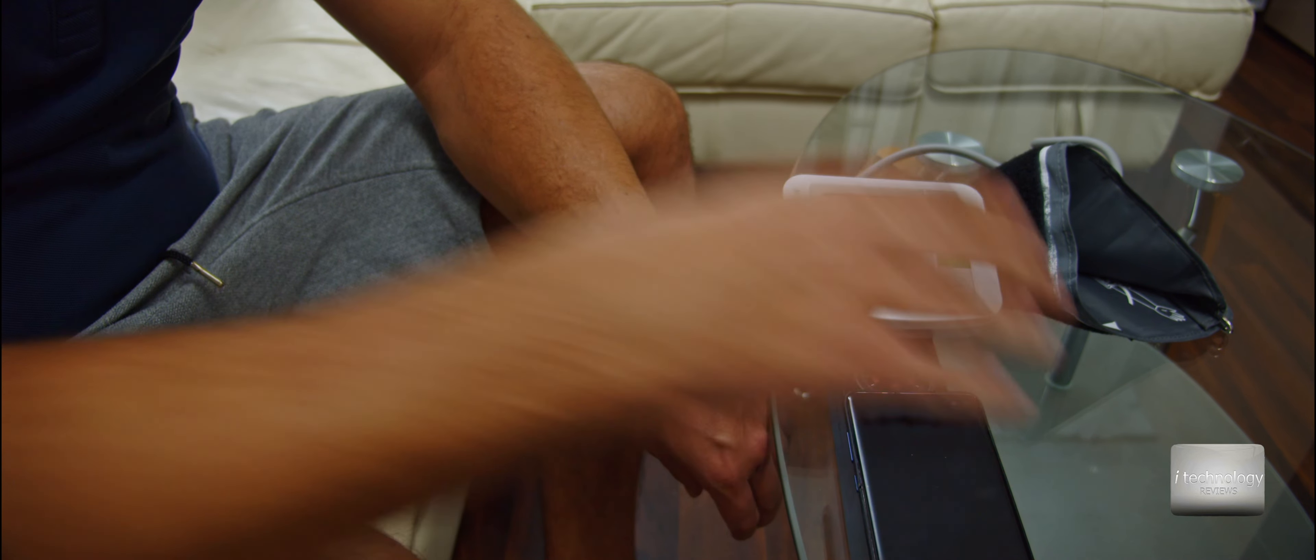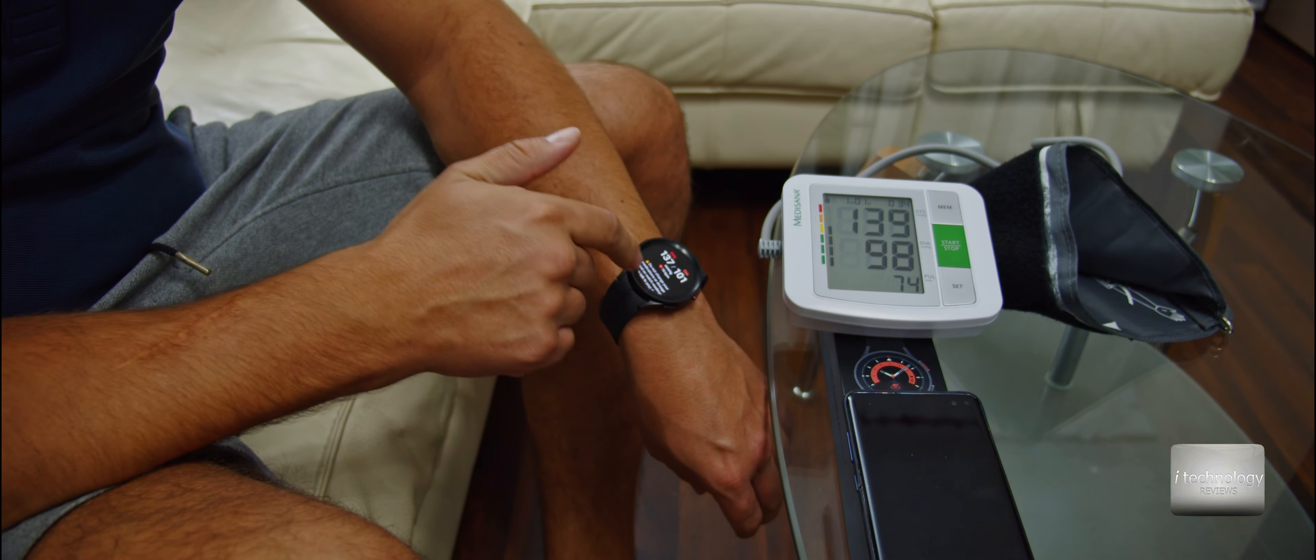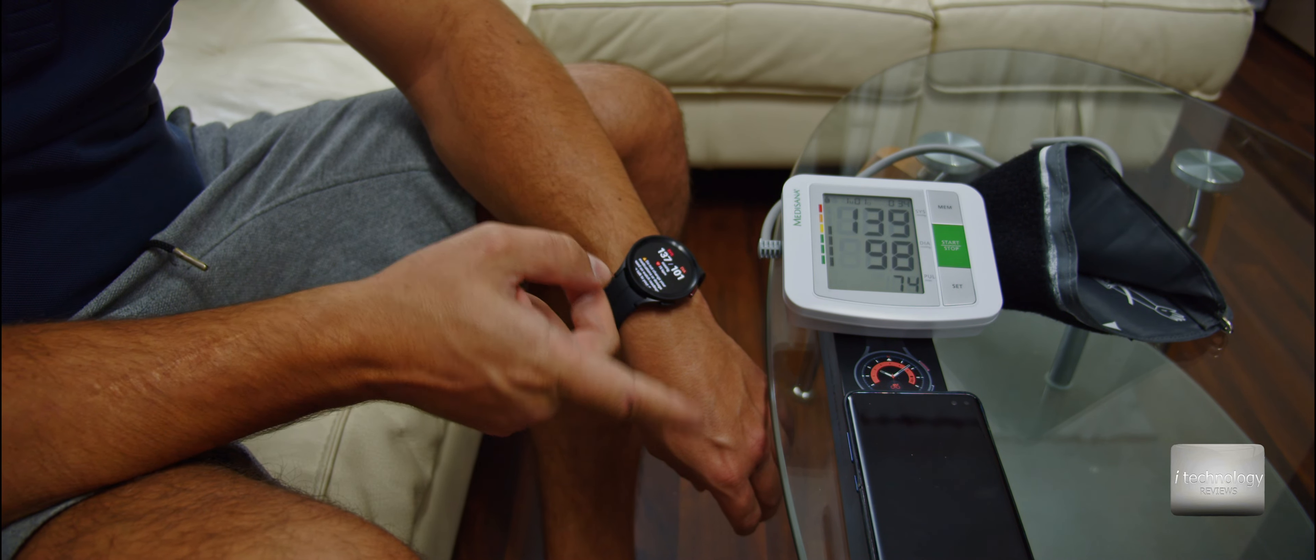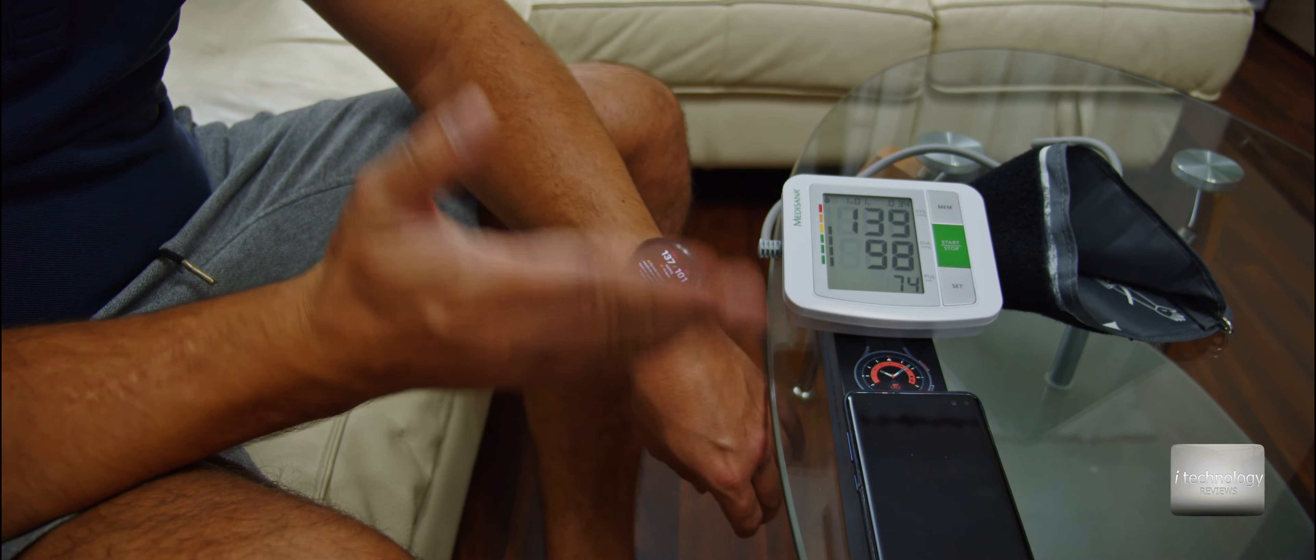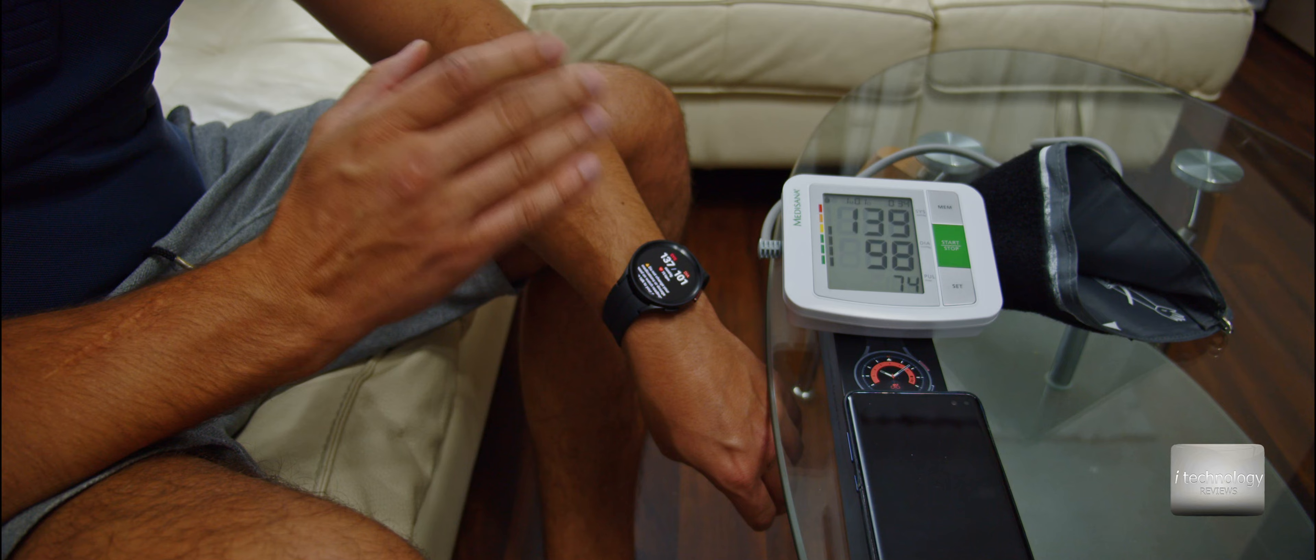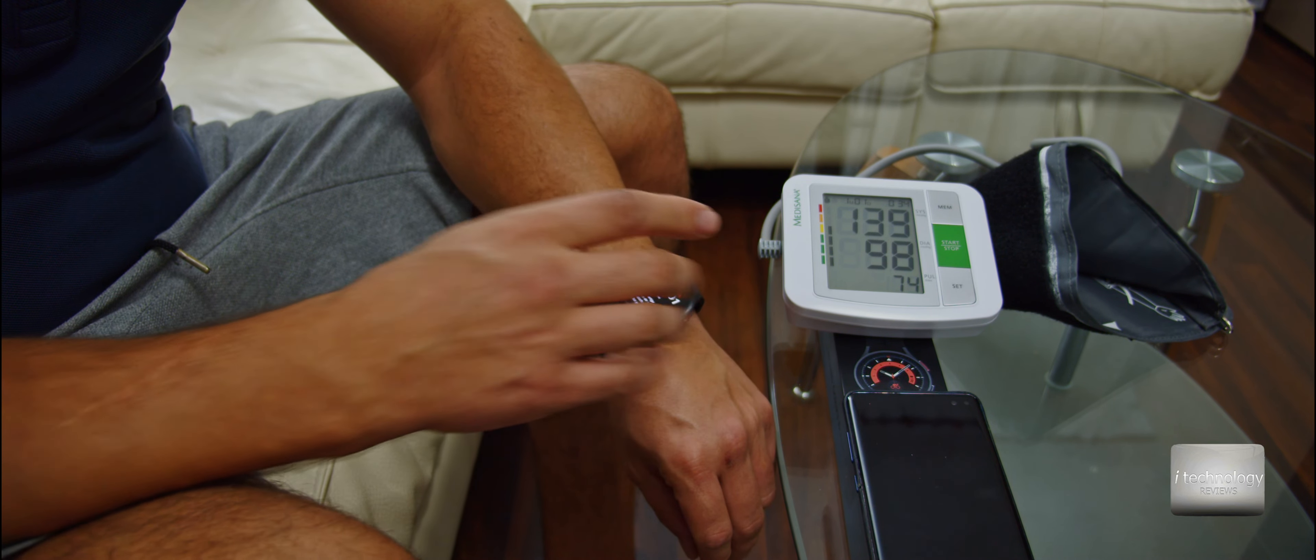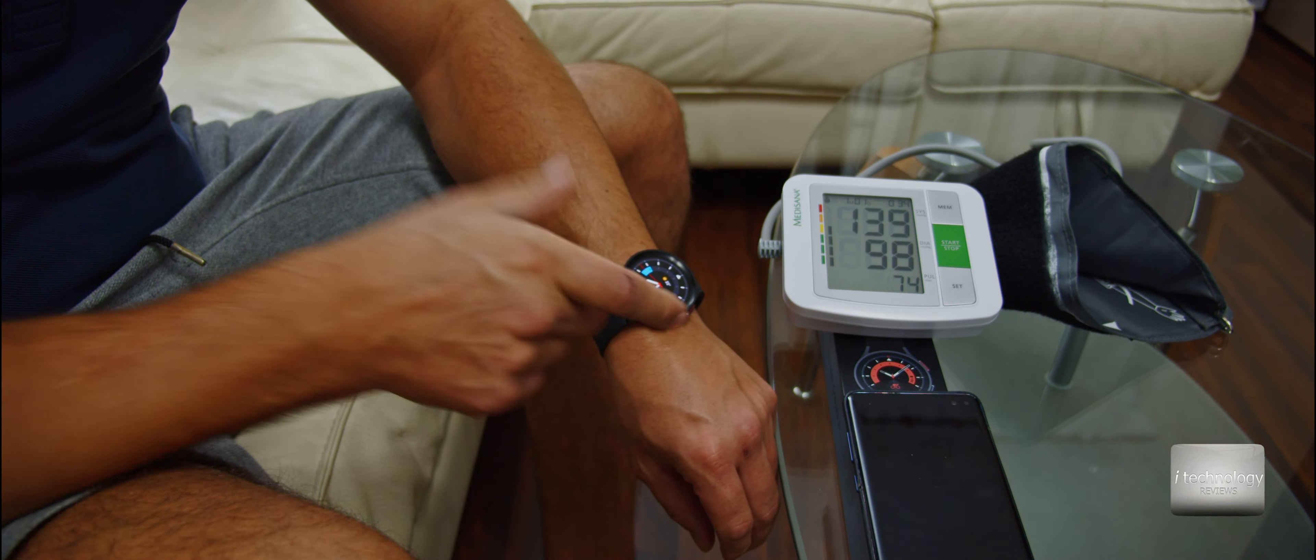I believe this is quite good and useful. If you make the calibration good and if you are standing still, this is another trick. If you're calm and you didn't make exercises before and drink coffee, the measurement will be more accurate than this. I think this is awesome to have at your wrist every time. This is how to do it guys.